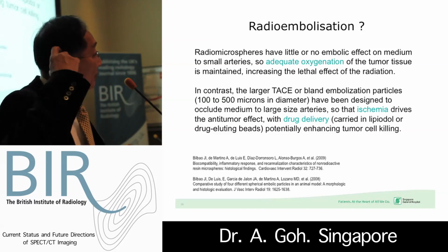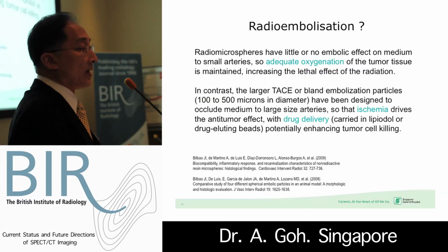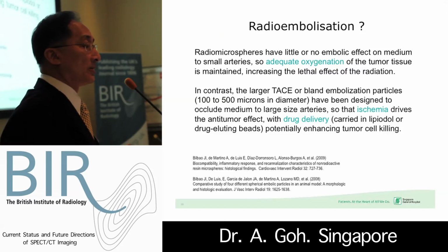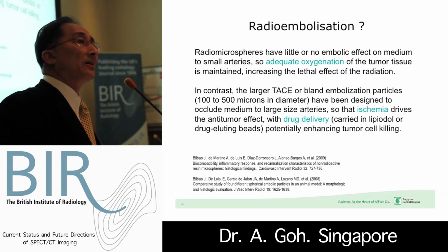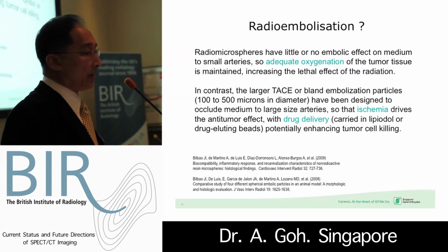So in actual effect, yttrium microspheres produce little or no embolic effect, and we do actually want adequate tissue oxygenation in order to have the free radicals to produce the destructive effects of the radiation, in contrast to TACE, in which the ischemia drives the antitumor effect, as well as the drug delivery.